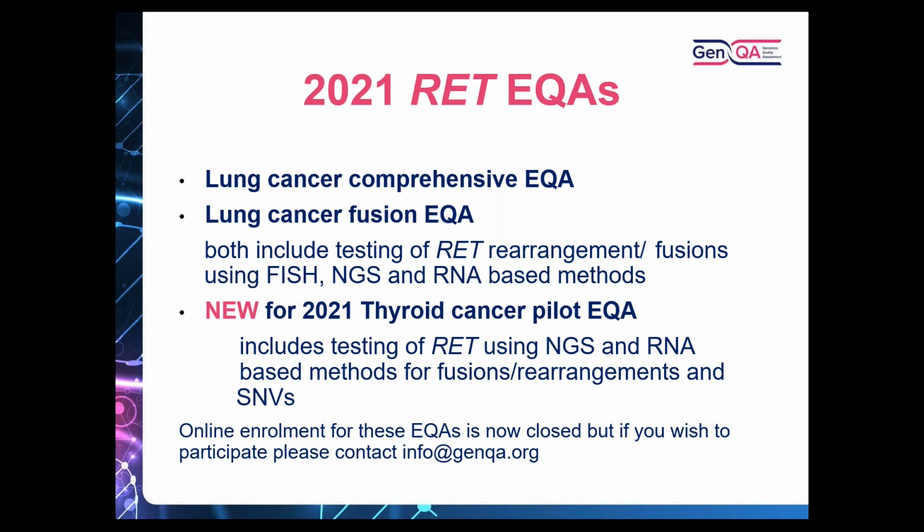And then we have a new pilot EQA in 2021 for thyroid cancer. That will look for RET fusions and rearrangements, again using NGS and RNA-based methods, but also for RET SNVs as well, as described for medullary thyroid cancer. Online enrolment for these EQAs is closed now, but if you're interested in participating in them, please contact us and we may be able to accept your participation into the EQAs.